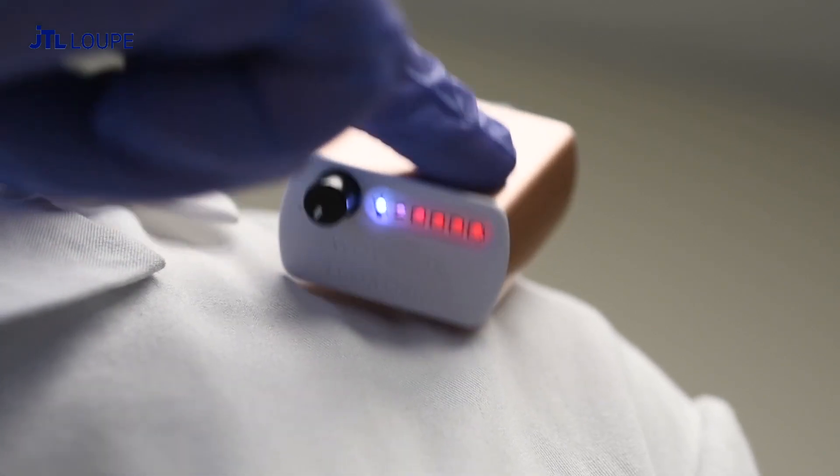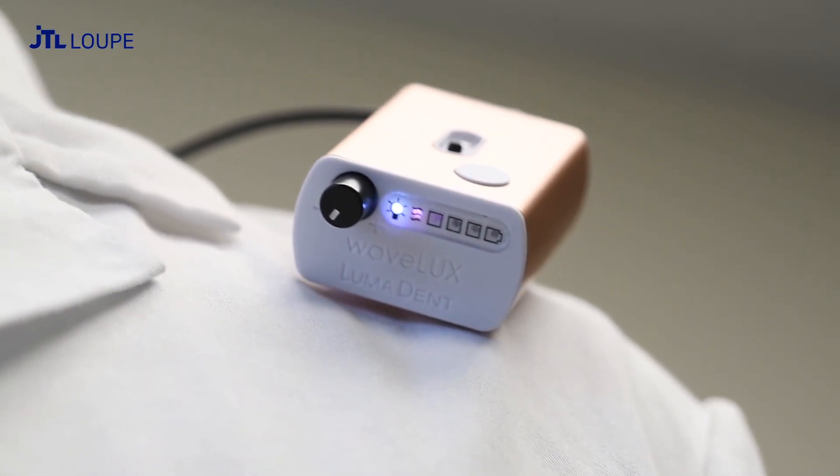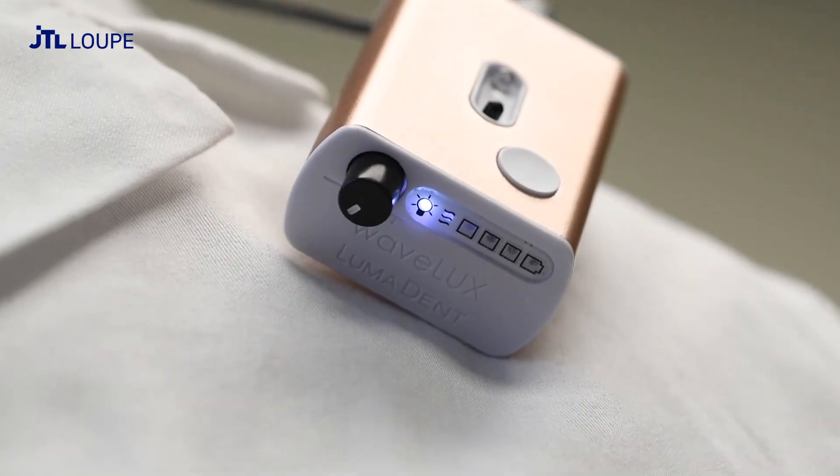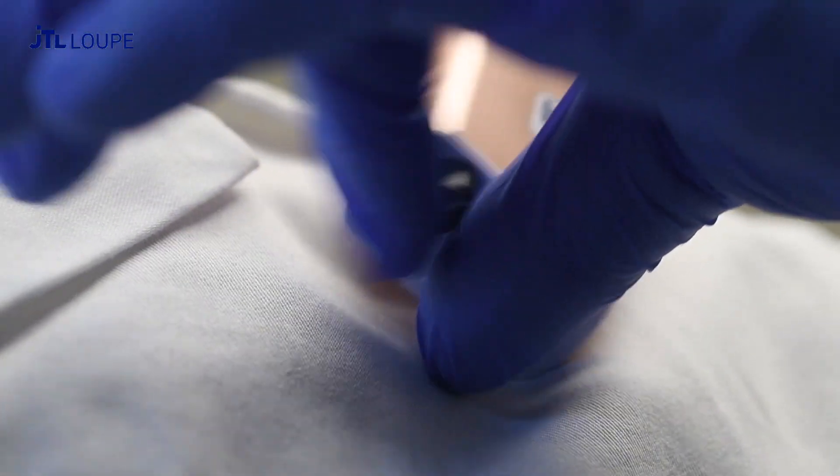Press the power button to turn the battery on. Wave within two inches of the wave sensor to turn the headlight on or off. Please note that the power must be on to use the wave sensor. Twist the knob to adjust the light brightness.